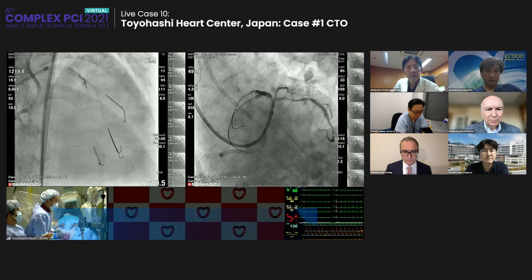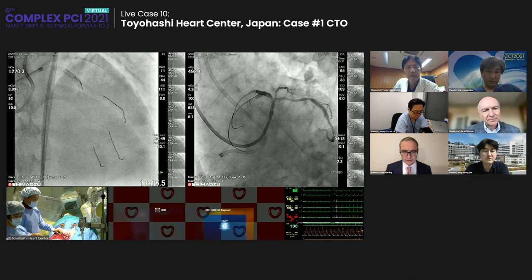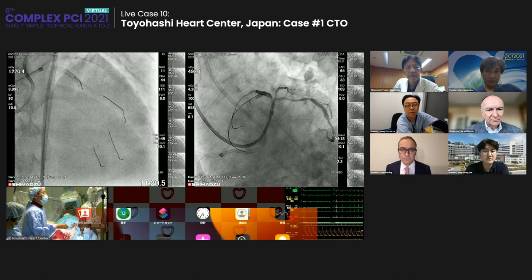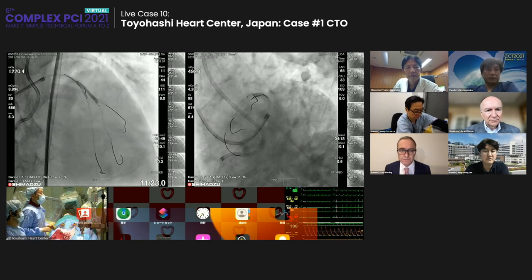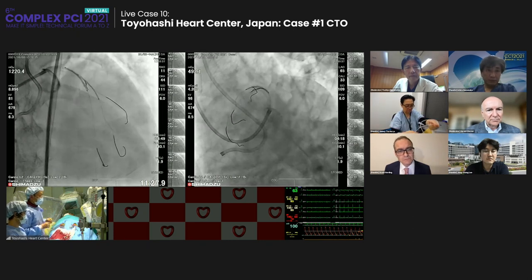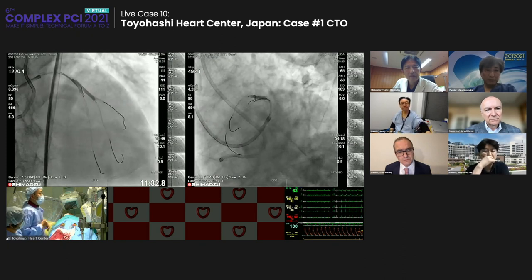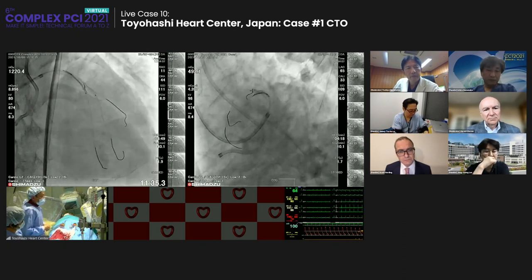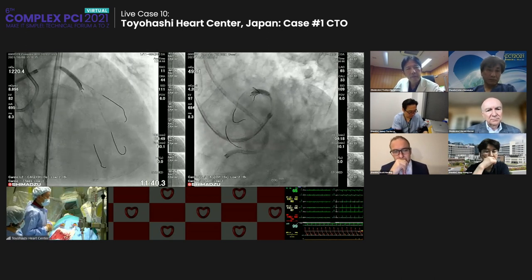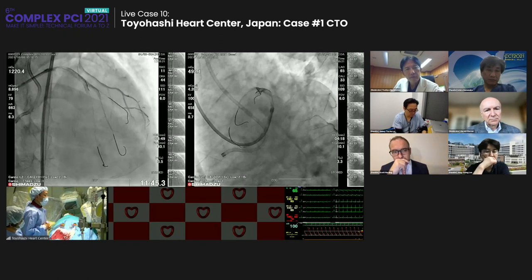Okay, can you bring us up to date? Obviously, you've put a stent. Yes. I selected the mini crush stent for bifurcation. I selected a 2.5x22 Onyx for the diagonal, and 3.0x22 for the LAD main vessel. So this is the end of the stent in the LAD. We can use the remaining wires at this end. So this is after the stenting.